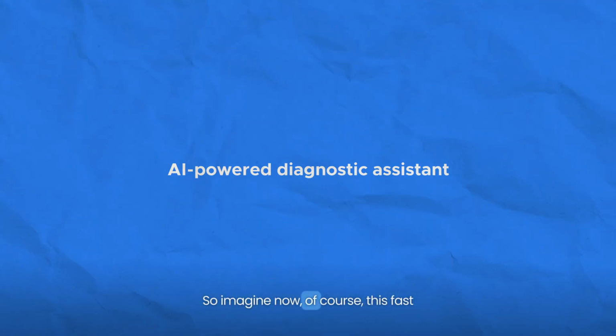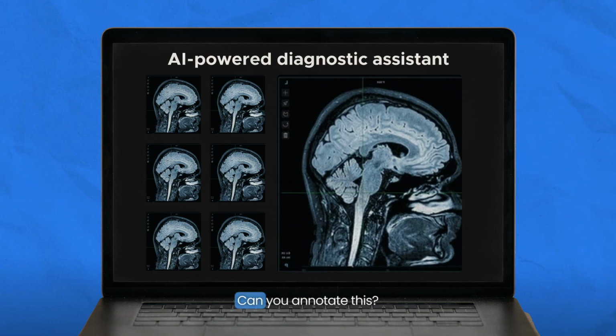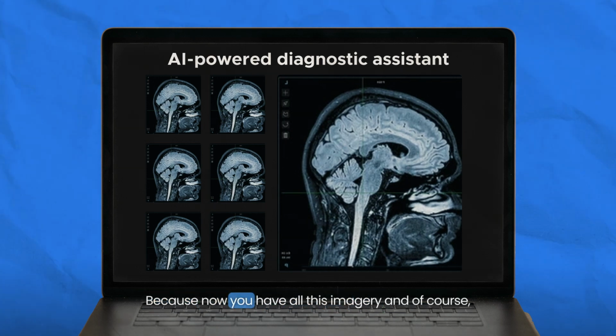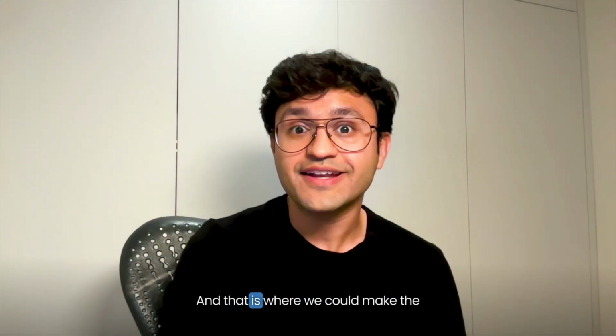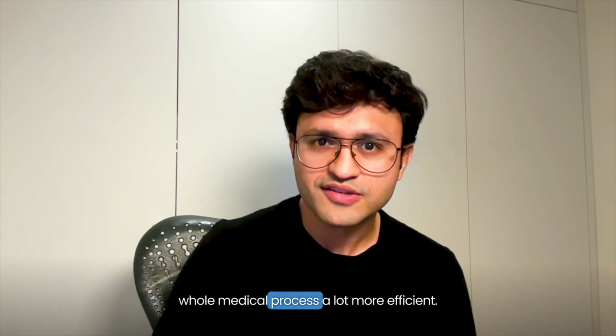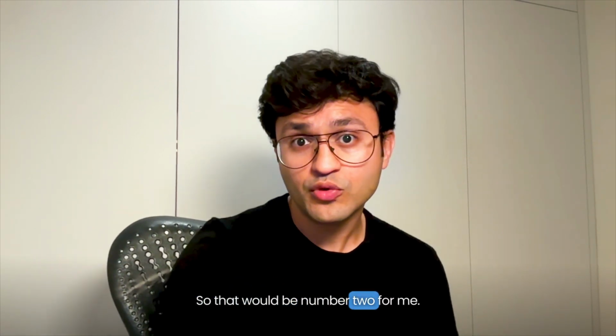Now, in terms of the second one, you could build an AI-powered diagnostic assistant. So imagine now, of course, this fast MRI dataset has created images. Can you annotate this? Because now you have all this imagery, and of course, the tool set has the annotations as well. So that could help radiologists quickly identify where there could be a tumor or an abnormality in the body and whatnot, right? So that also saves some time, and that is where we could make the whole medical process a lot more efficient. So that would be number two for me.